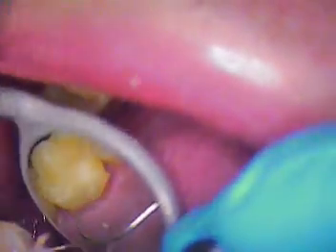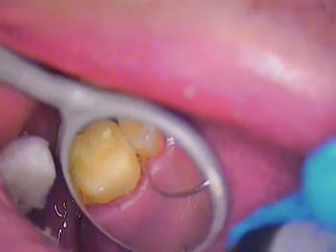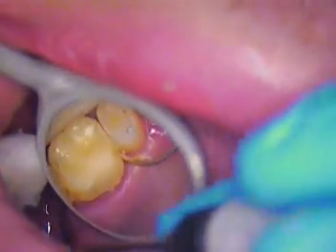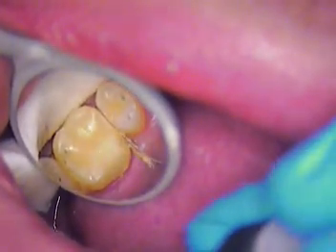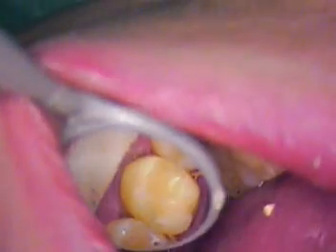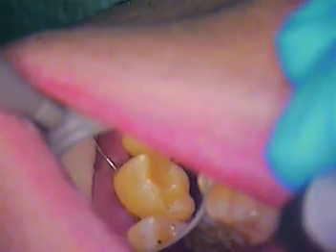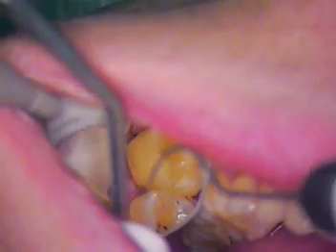All right, there's our cord. It's all nice and freed up from the lingual, and here's the other cord. Okay, so that's all one piece. Let's see if we can push it through from the lingual to the buccal aspect. And you just keep pushing. Keep pushing on. All right. Get up into this area here. Close a little. Let's see if we can. There it is. See, as I tug on this, it wants to free up from the lingual. So see it come through all the way through? And we'll just pull that right out like that.